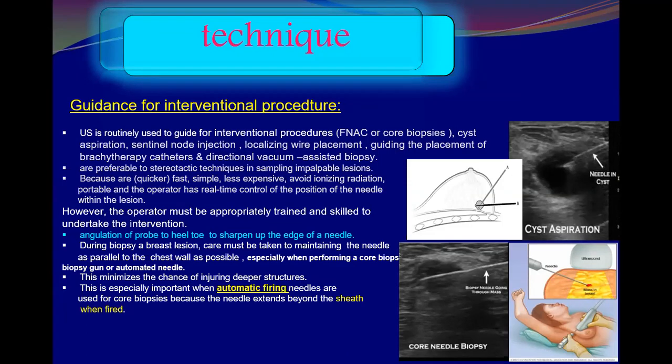Why is it preferable over the stereotactic technique? Because it is quicker, simple, less expensive, avoids radiation, portable, and has real-time control of the needle.